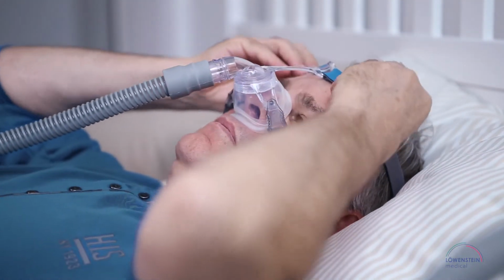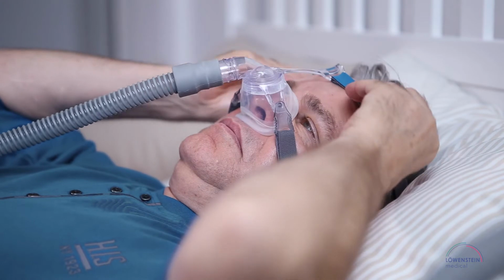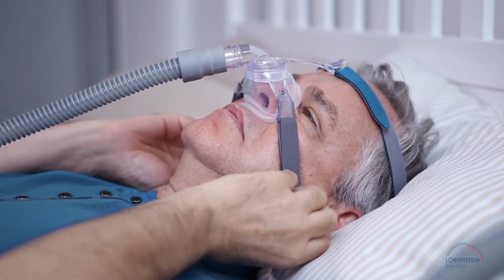If the mask is not airtight or it presses on your face while you're lying down, readjust the headgear.